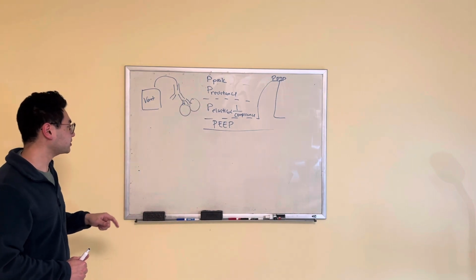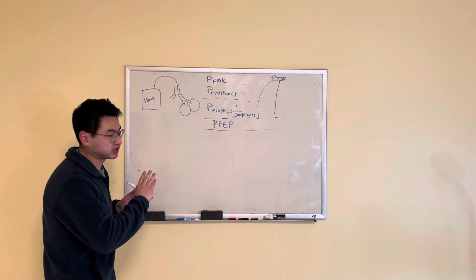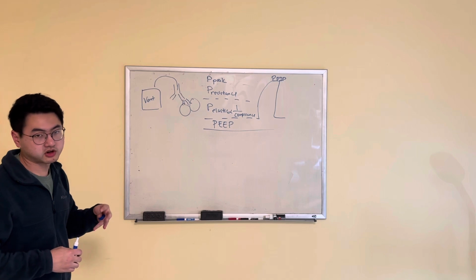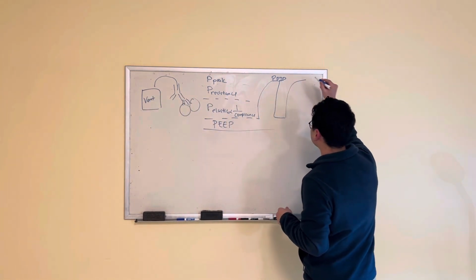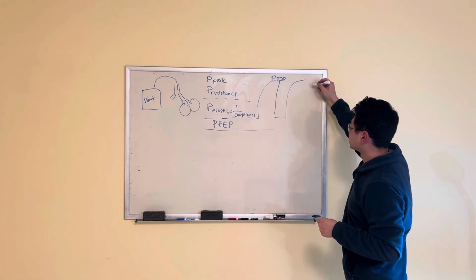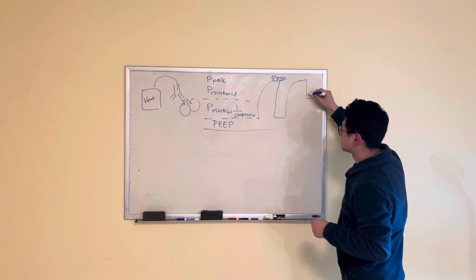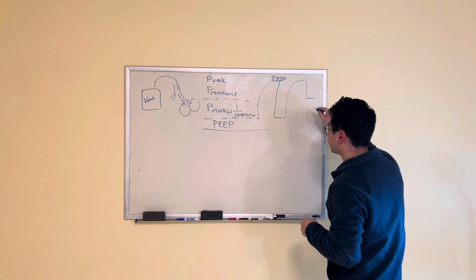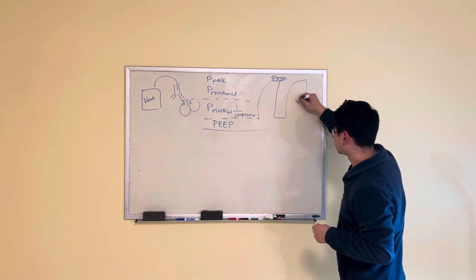So what an inspiratory hold does is it essentially gives the pressure when the resistance in the airway is 0 after a maximum breath. So what we see here is this maximum breath, and then you do an inspiratory hold, you give just enough pressure, and then you can overcome the alveoli, and this is called a plateau pressure.